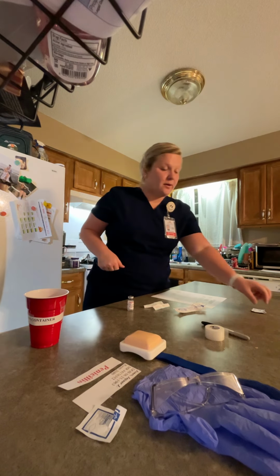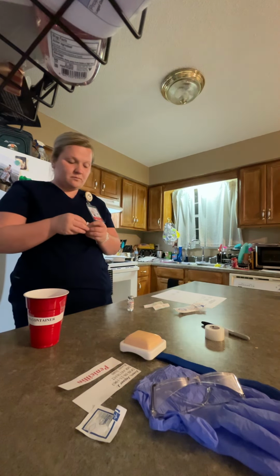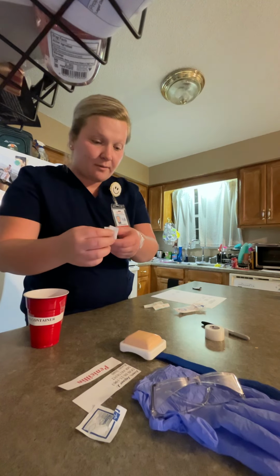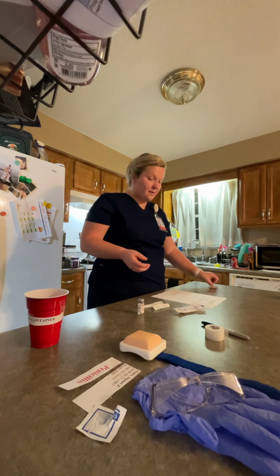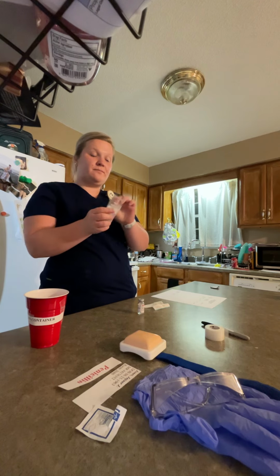Now I'm going to clean my vial. While cleaning my vial, I will clean from the inner circle to the outer. Throwing that away. Now I will get my 3 milliliter syringe.